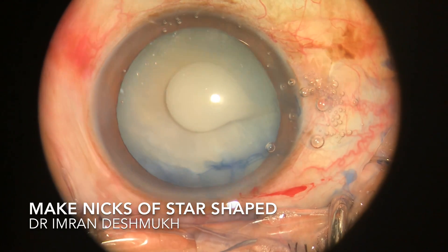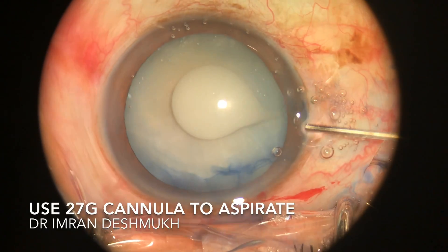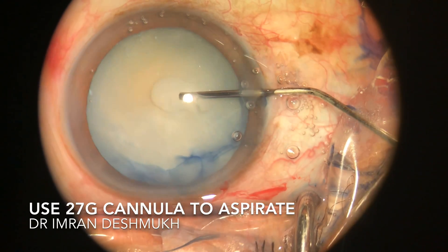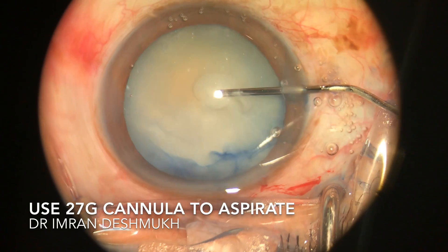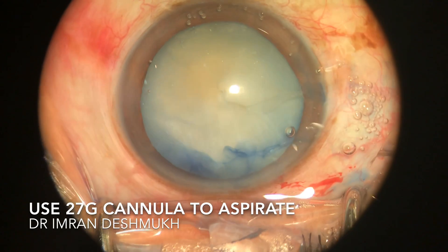Once I see that all the fluid has come into the anterior chamber, I slowly insert the 26-27 gauge cannula through the sideport and try to aspirate as much fluid as I can. Remember not to touch the anterior capsule and to be very careful — gently remove as much fluid as you can.